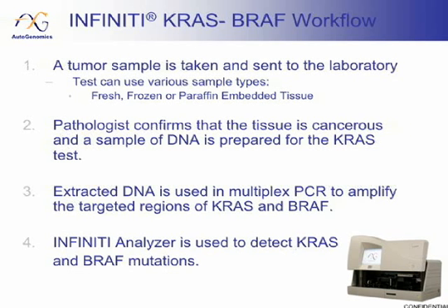In our case, it's a multiplex PCR reaction to amplify the targeted regions of KRAS and BRAF. And then we would run that on our Infinity Analyzer to determine which mutations were detected for both KRAS and BRAF.